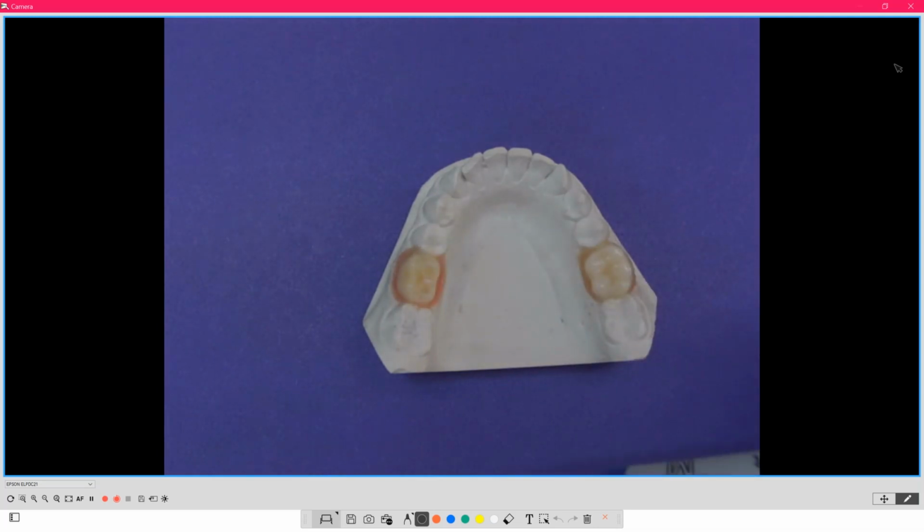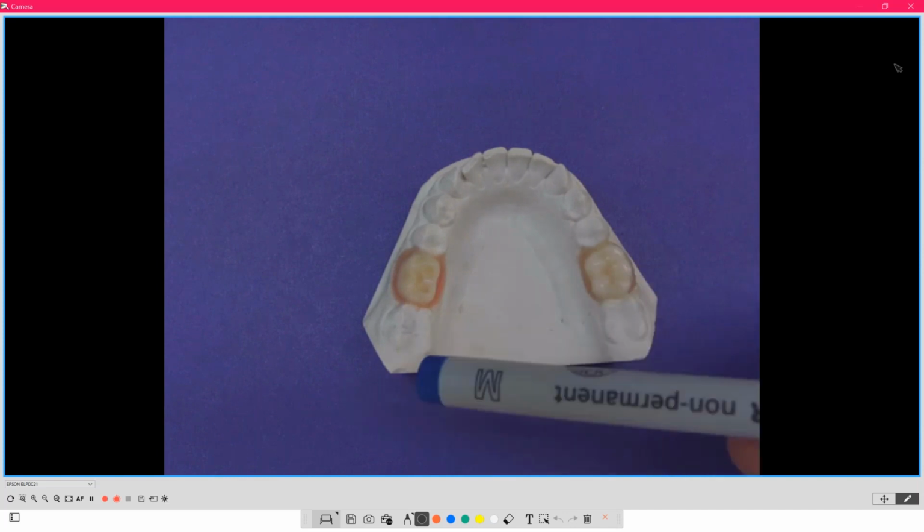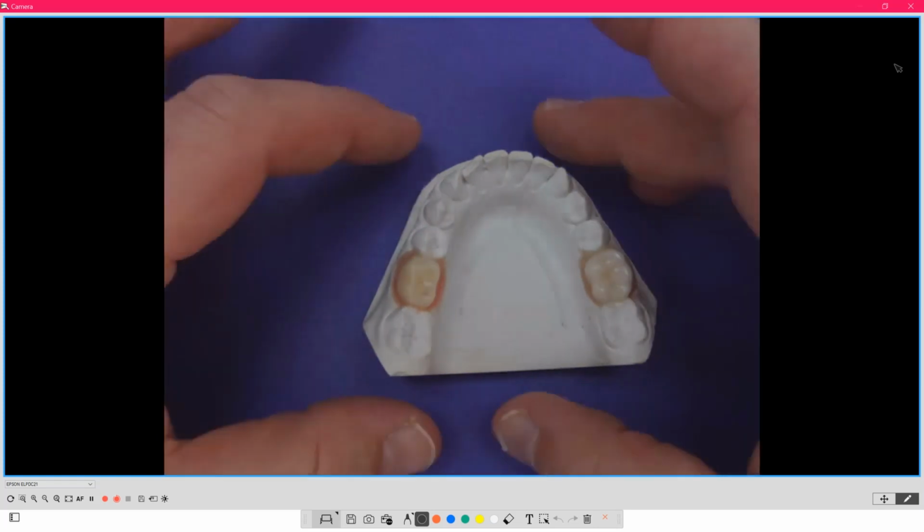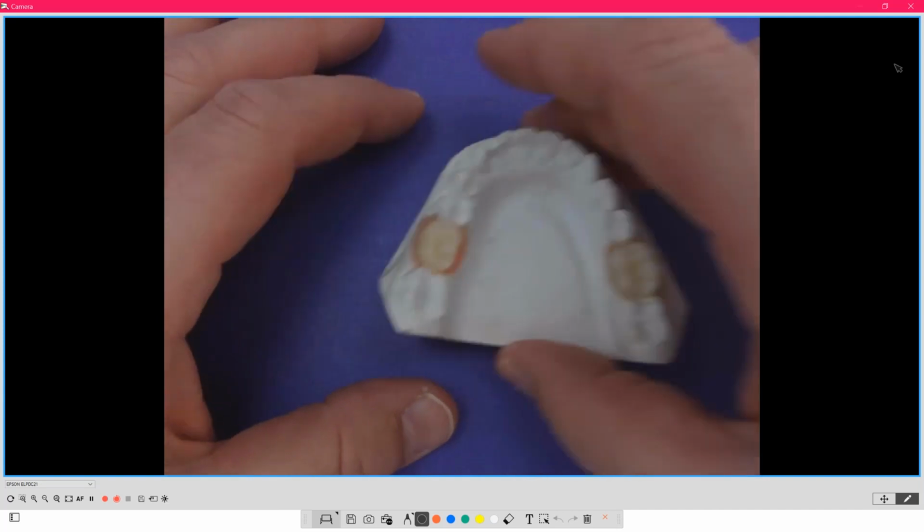And then you can help educate them, not only for yourselves, but for the patient to understand the price difference. You know, the other thing that we look at, even for those of us making dentures, this is more natural based. This is 1950s thinking. That's what we had back then. This is more trending, this is more common, and this is more natural based. And this is where we've been going with denture teeth, for the reasons that I'm laying out for you. So this is a nice little tool to show patients as well.